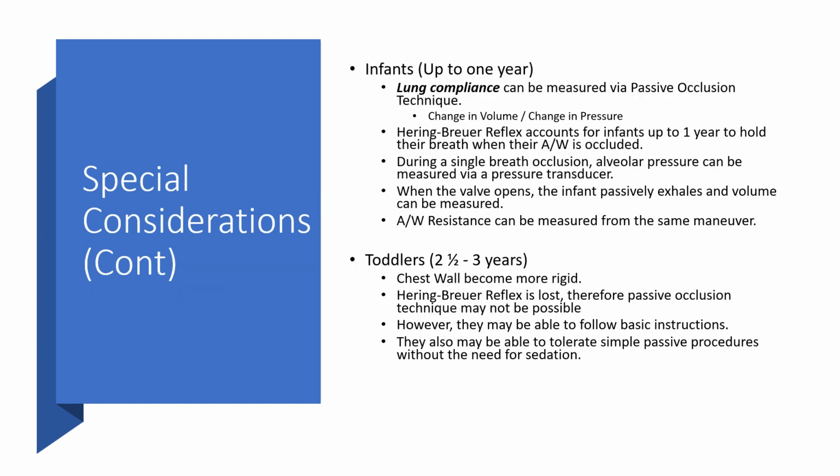Now, building on the special considerations, in infants up to 1 year, their lung compliance can be measured passively by what's called the passive occlusion technique. And it really is based on Boyle's law, where there's a change in volume over change in pressure. So something to consider is that the Hering-Breuer reflex accounts for infants up to 1 year holding their breath when their airway is occluded. Now, we obviously don't want them holding the breath for any long period of time, but this could be useful.